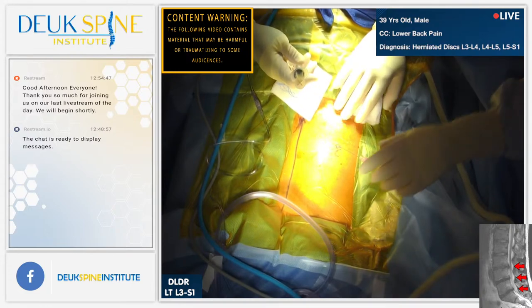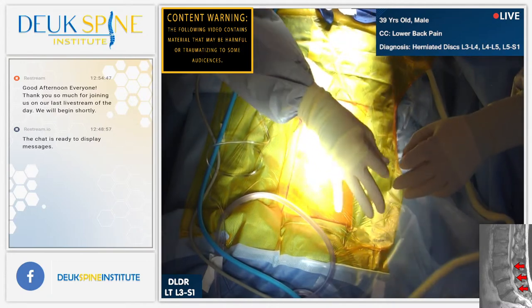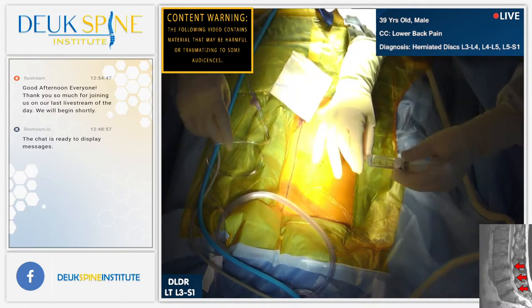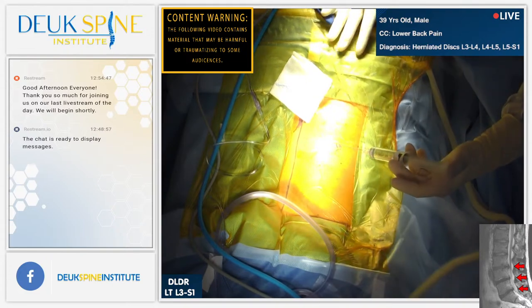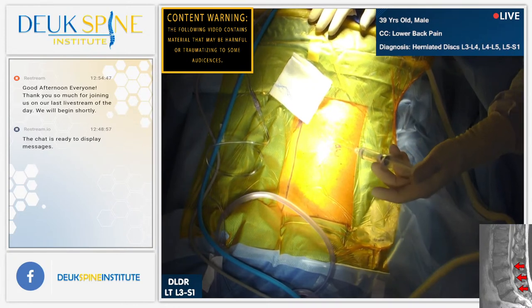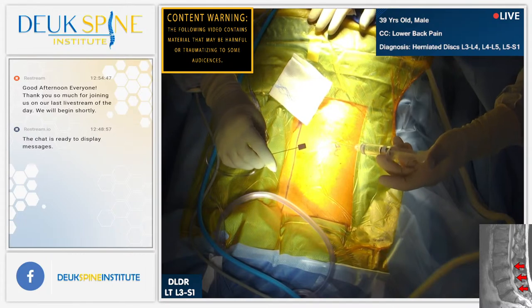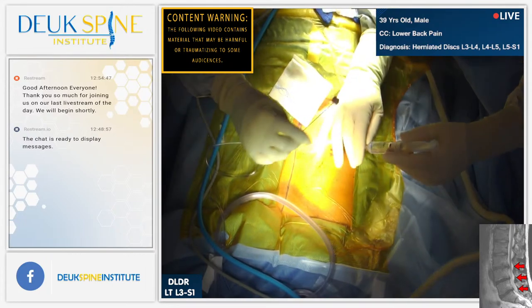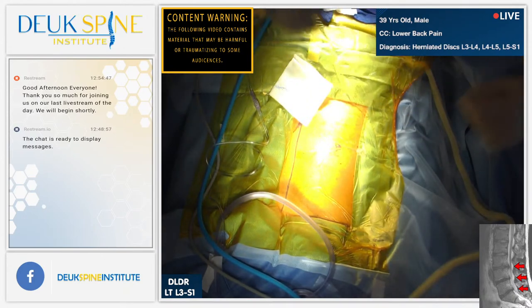It's now April 13th, 2023. And we're going to be streaming spine surgery done on an awake patient who's sleepy, but not intubated. And we're going to be doing something called the Deuk laser disc repair, which is a surgery that's minimally invasive and endoscopic.